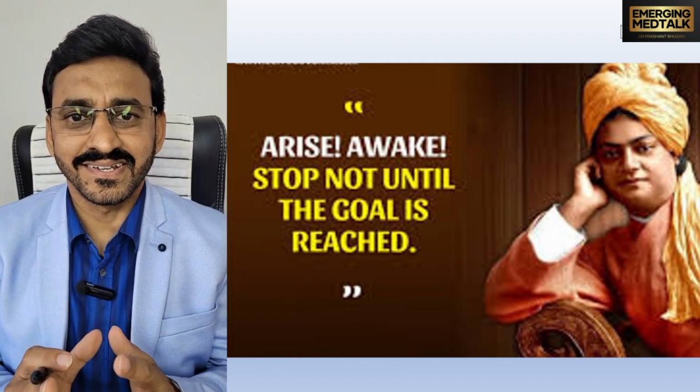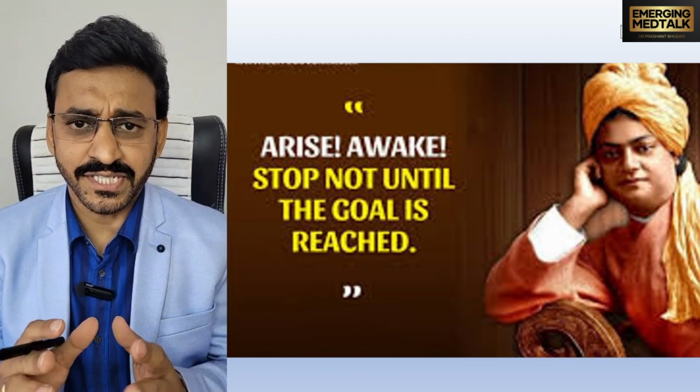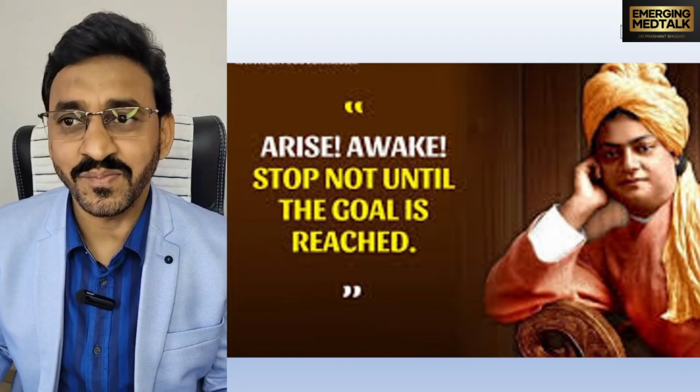Hello everyone. We are discussing various X-rays under the space reflection, how the various anatomical landmarks reflect on the X-ray. We'll see step by step.